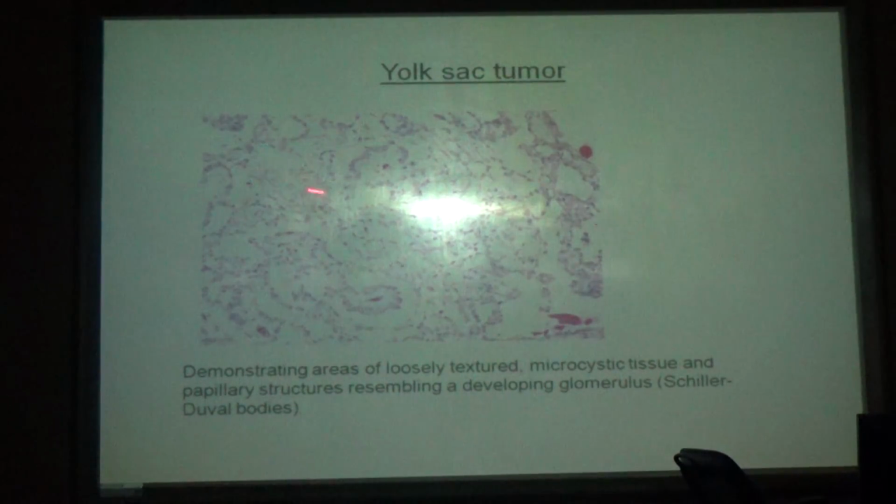One more feature of this yolk sac tumor is what it resembles. How is it resembling? Tariq, can you pick it up? What? How is it resembling? This one.